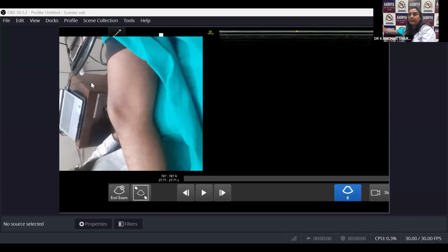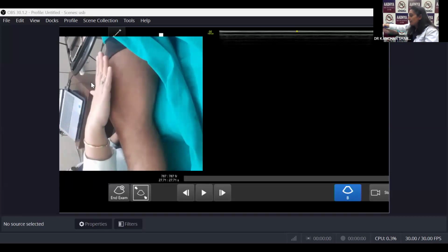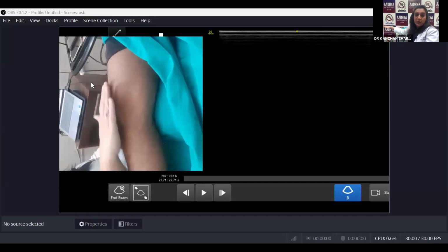In the shoulder class or some other class, you would have seen us teaching that whenever you want to look for any kind of tendon, you do the opposite action, so that you are stretching its fibers and you will be able to see the tendons very nicely. So we have the quadriceps tendon, which is going and getting attached on the base of the patella.